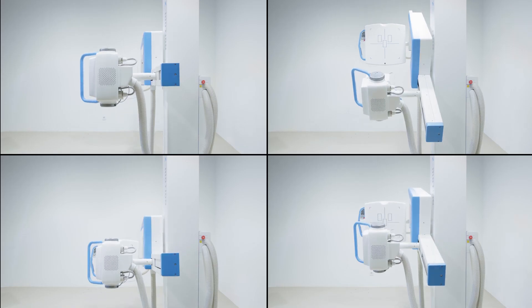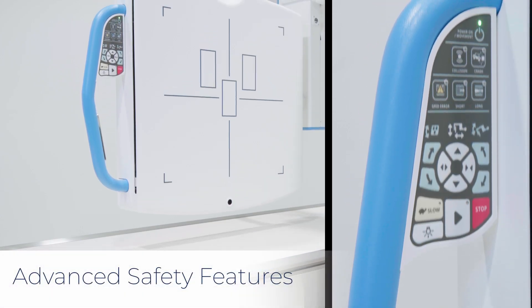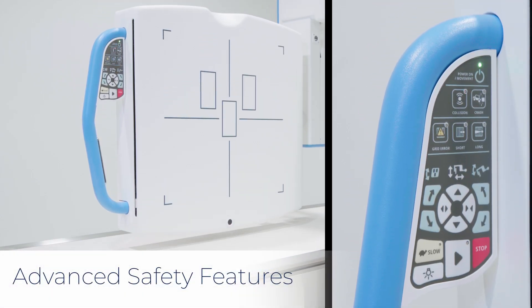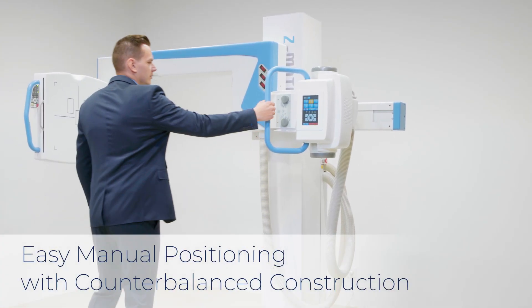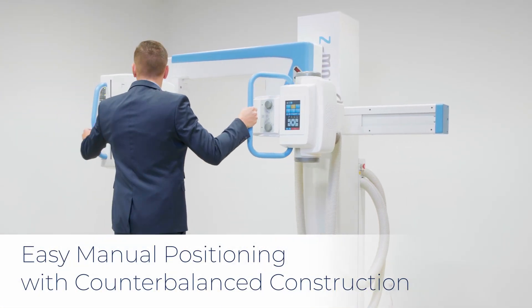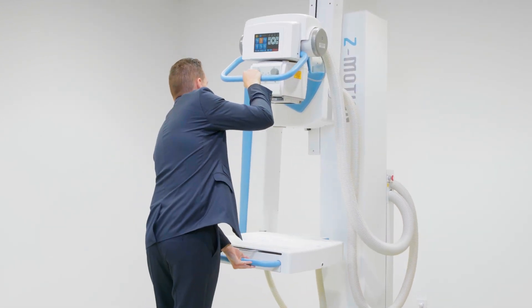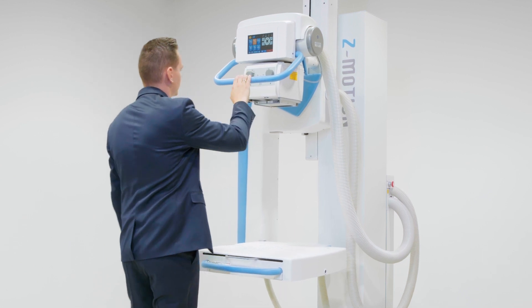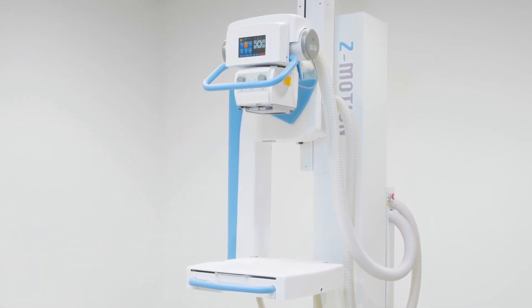The Z-Motion is built with low impact motors for maximum patient safety. Safety is also ensured by proximity sensors tasked with preventing collisions. In addition to its sophisticated motorized movements, the stand allows quick and easy manual positioning thanks to its fully counterbalanced construction. This is a key distinguishing feature compared to other U-arm systems.